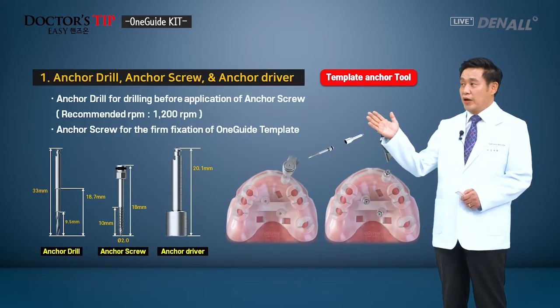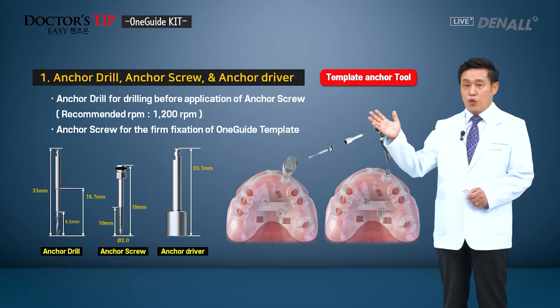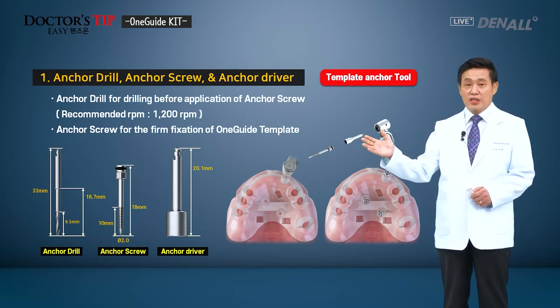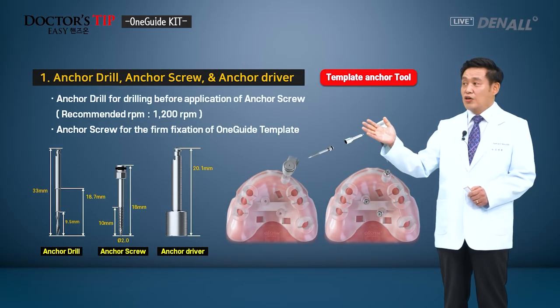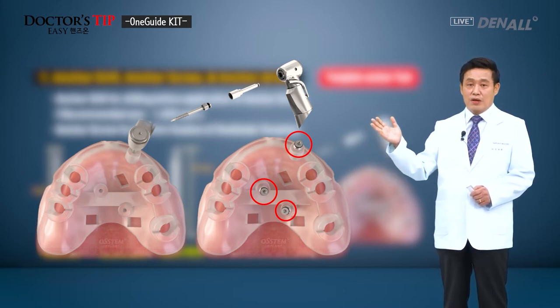First, the anchor drill, anchor screw and anchor driver. As mentioned before, you can fixate the OneGuide template more firmly. In the case where there are teeth, the OneGuide template does not really move. But if it is fully edentulous, because of the resilience of the mucosa, the template can move or there can be deviations. So using anchor screws, if you place anchor screws on the palatal and buccal area, you can fixate the template position and maintain it more firmly.